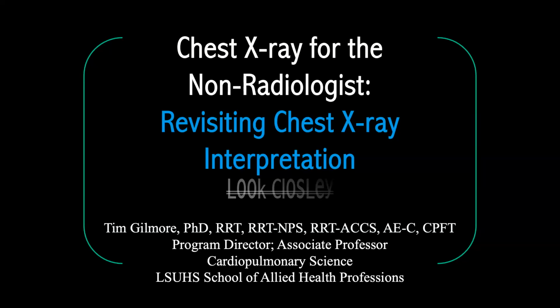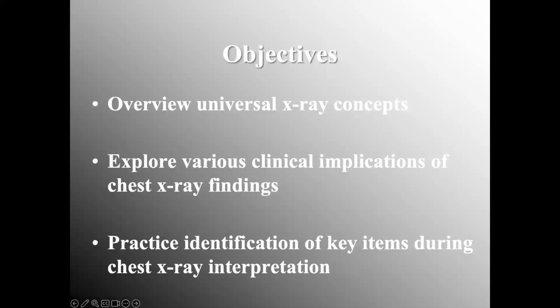So as we move along, remember that not everything is always black and white, right? So these are just our general objectives for today. And I notice probably the most important for all of you on the call would be objective number 3, to practice identification of key items during chest x-ray interpretation. We're going to put it to use today.